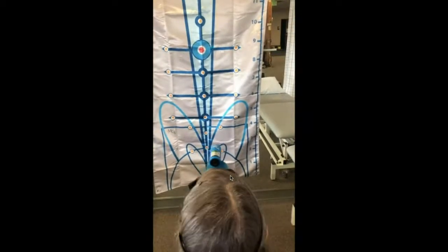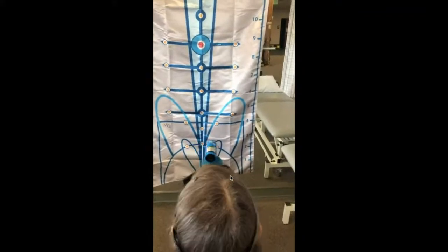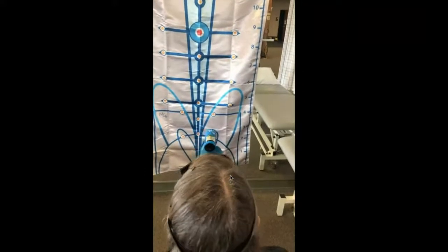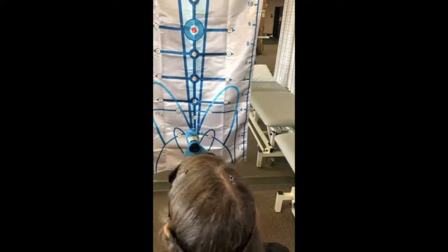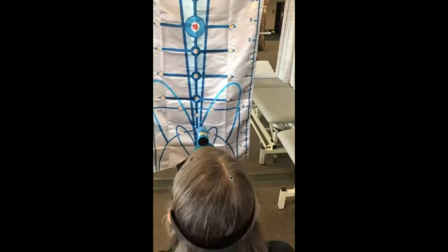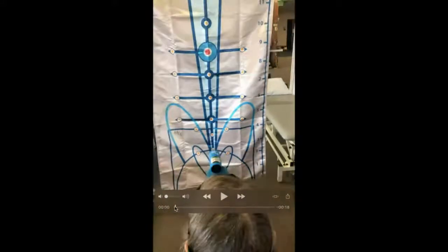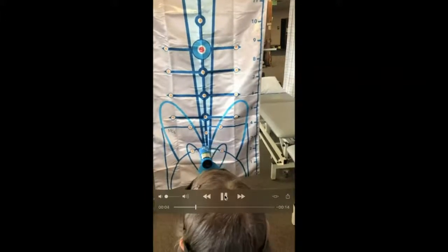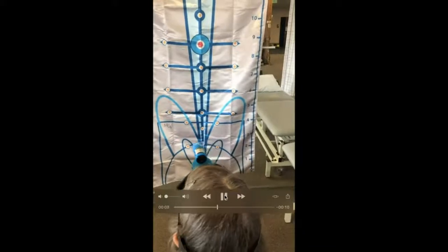you'll definitely see an increased uniformity in her excursion side to side. It's not perfect, but this is all inside one training session, just different repetitions with it. Less titubation going up and down. She's getting a better understanding of what level on the horizon is with her VOR, and she's showing dramatic improvement by allowing herself to get better understanding with visual representation of this.